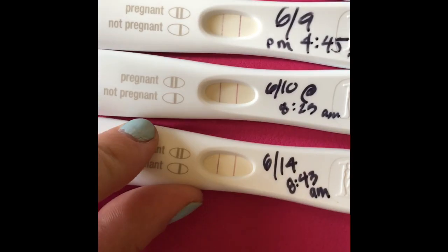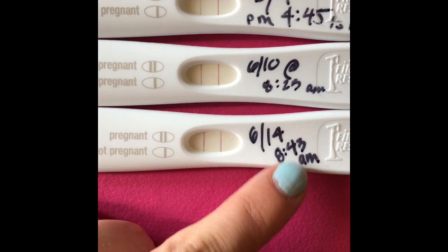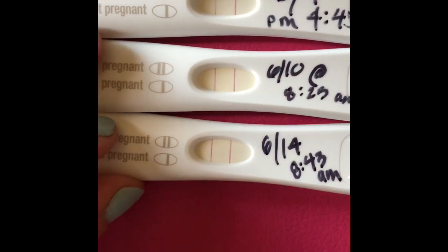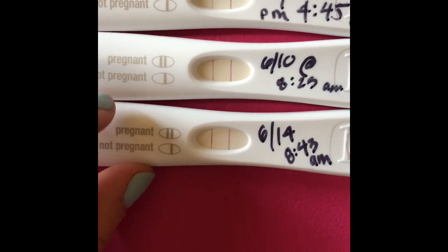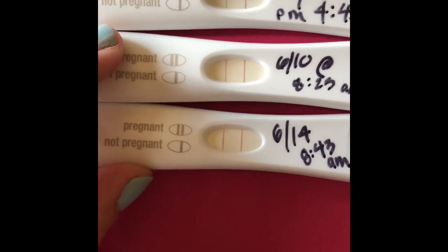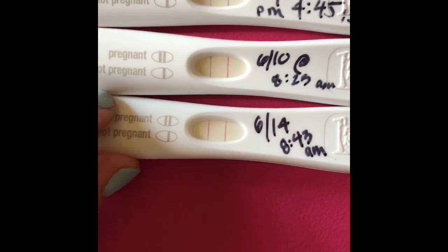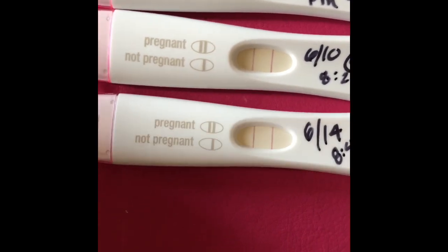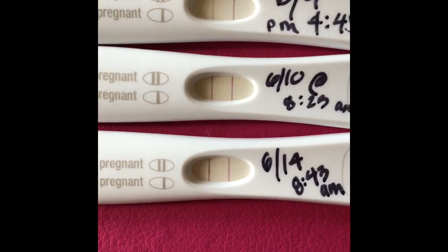But this test is what really made me sick all day, and I wish I would have never taken it because I had a blood draw this morning and didn't get results till later that afternoon. And from the 10th to the 14th, really didn't look that different. And I was 19 DPO on this day, so I was expecting this test line to just take all the dye away from the control line. Well, to my relief, my HCG levels were 2,212 this day, and I had my blood draw like an hour after I took this test. So my numbers were in the 2000s, and this test doesn't look much darker than when it was probably 200.